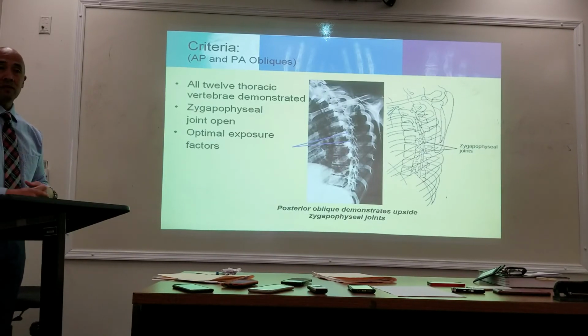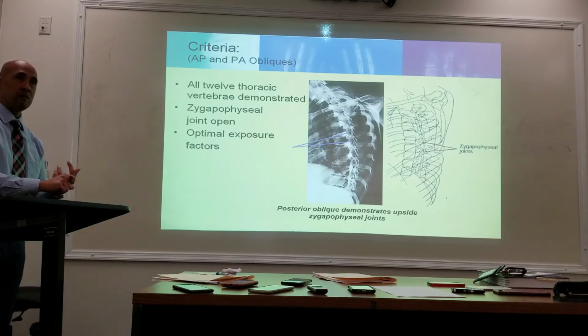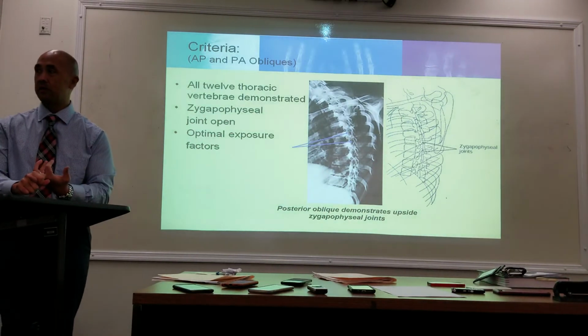But for test purposes, you're going to do it on what? On expiration. So AP is on expiration, oblique is on expiration, the lateral is going to be breathing technique. Okay. All right, any questions?